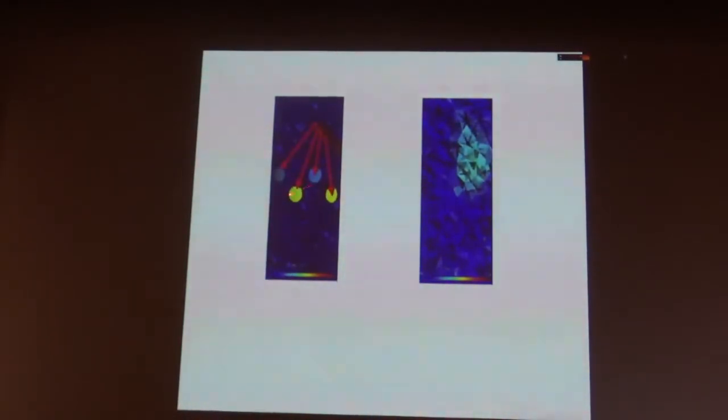Look at this. This is just a simulation. I have a rod here, and then the influence of this rod in these electrodes is completely different if the rod is in this other position. Which means that then I can track the movement along the cranial-caudal axis of this rod. For instance, look at this. I'm going to move up. You see? So we can see something moving from the caudal lung to the upper lung.